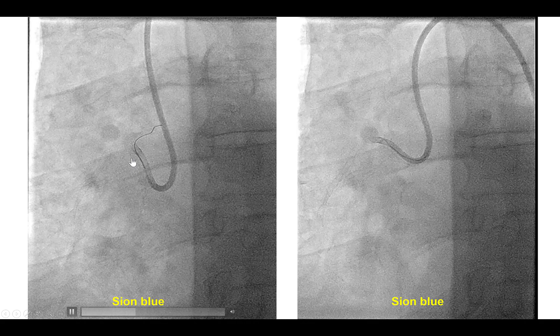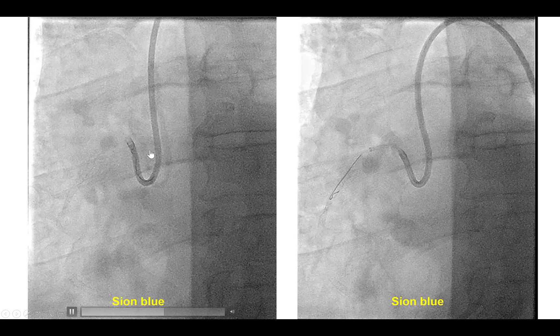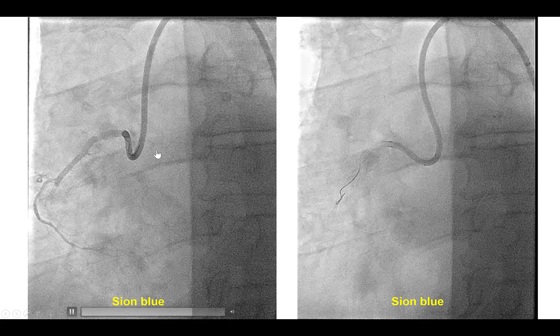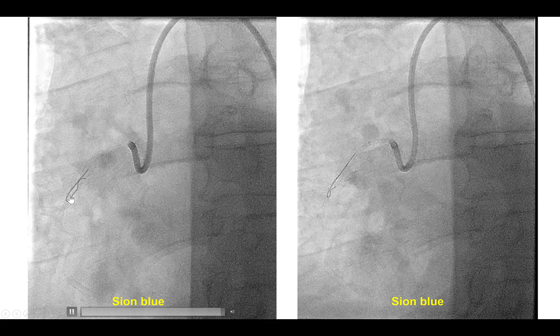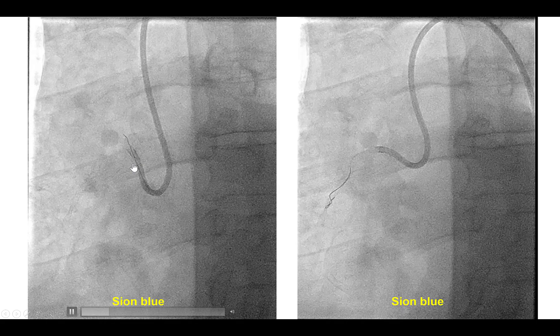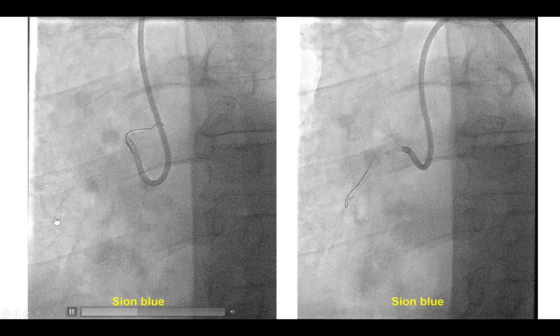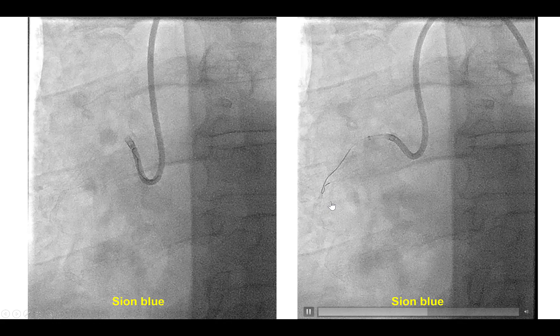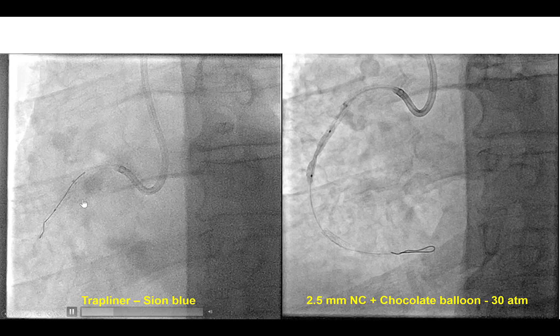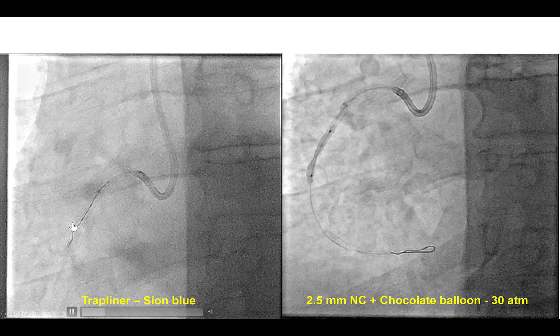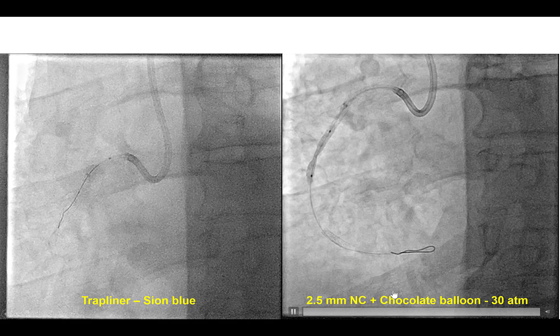In this case the patient was referred to us to treat this undilatable lesion. We went femoral with an AL-1 8 French guide, having strong support for anything we might need to use. For such under-expanded stents, we always prefer to wire with a knuckle if possible, because wiring with a bare tip might go under the stent struts and can be very challenging. Unfortunately here the knuckle could not cross — it was so tight in the RCA that even the knuckle wire would not pass through. We used a guide extension and were able to advance a workhorse guidewire looped all the way down the vessel. We then used the plaque modification Chocolate balloon up to 30 atmospheres, but once again there was a waist in the balloon.